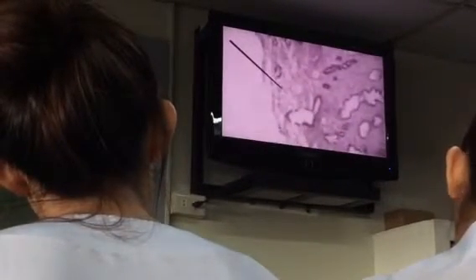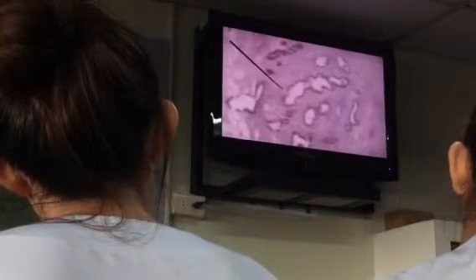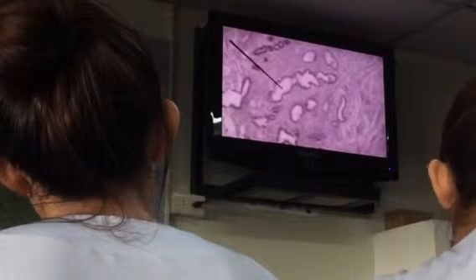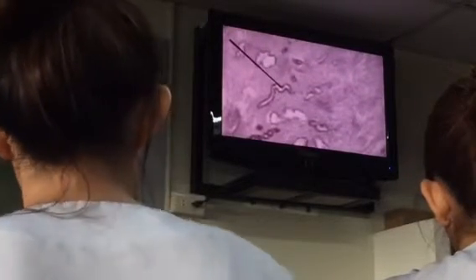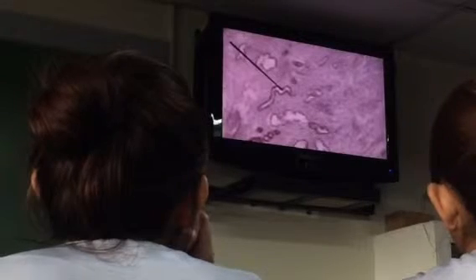So mas puti, parang naghihiwa-hiwalay na, that will be functionalis. Okay? Now these are your glands. No? We call this uterine gland. Okay? So as you get near your menstrual period, it gets more tortuous. Okay? This uterine gland.